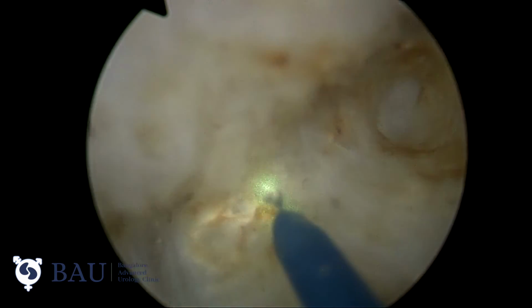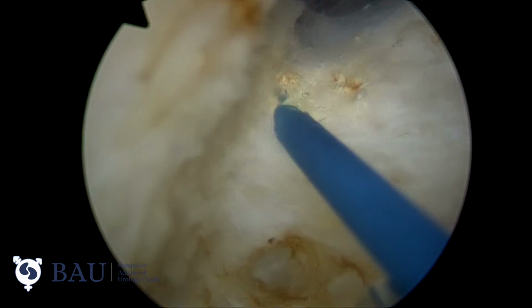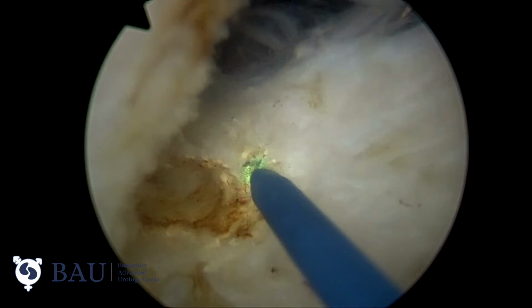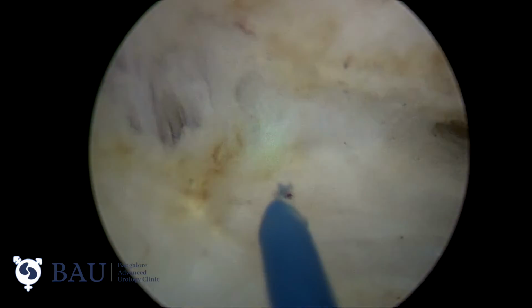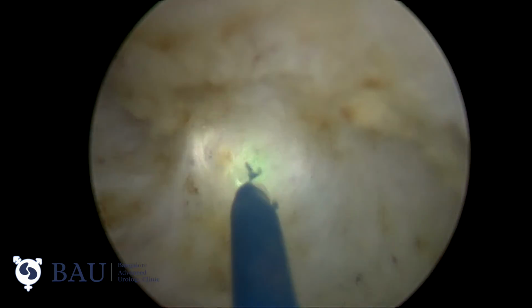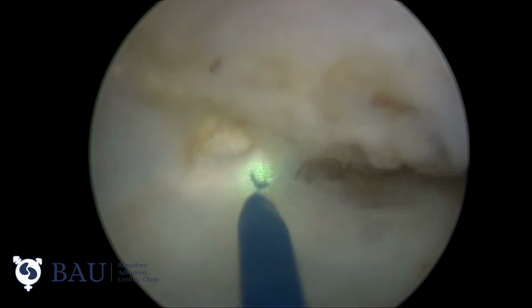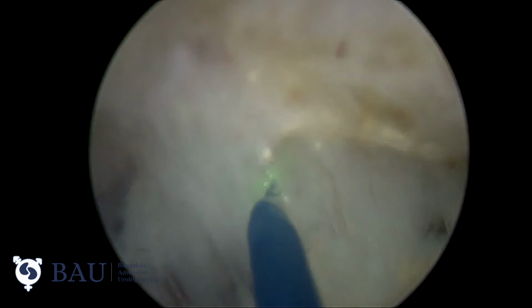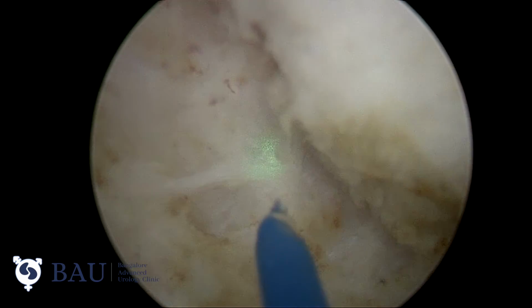Especially with prior infections, it becomes difficult in this zone. Here you can observe slight pressure may cause capsular perforation and undermining. You can see slight undermining in that zone.